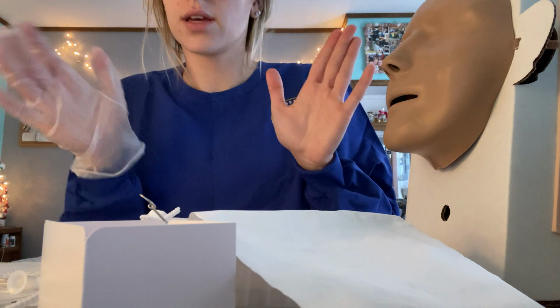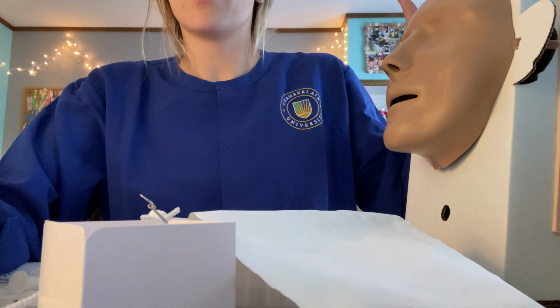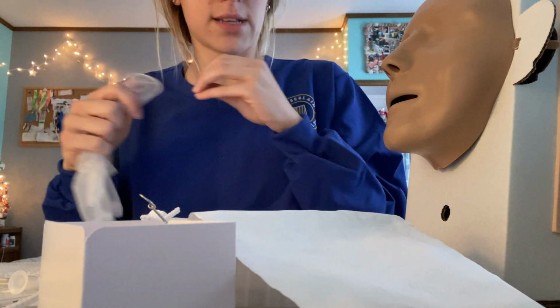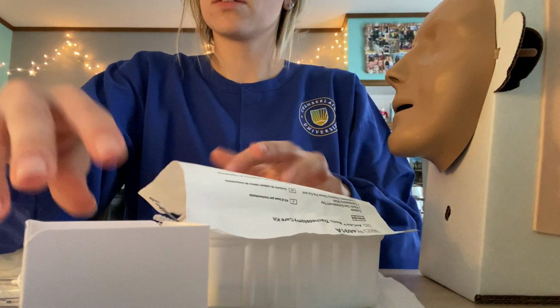So I would get all that ready, and it'll be tied throughout, and then I would make sure that the old ties are in place and so forth. And then after that, I will make sure I fasten the ties on each side. Make sure they're secure, that the trach is in place. And then I will make sure I discard all the stuff that I was using.